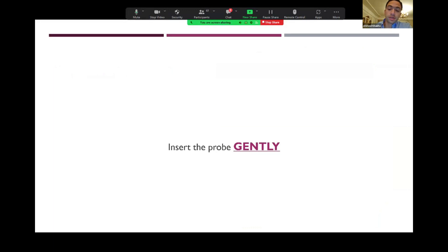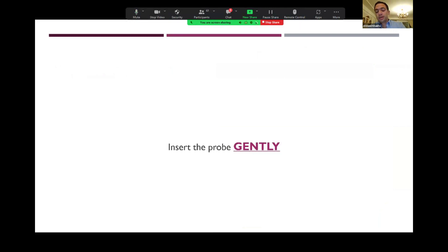Before starting the ultrasound examination, you have to keep in mind that this patient is actually in pain. The pain threshold for such patients can be low, so you have to be as gentle as possible not to cause any discomfort for the patient, so you can examine her thoroughly and meticulously.